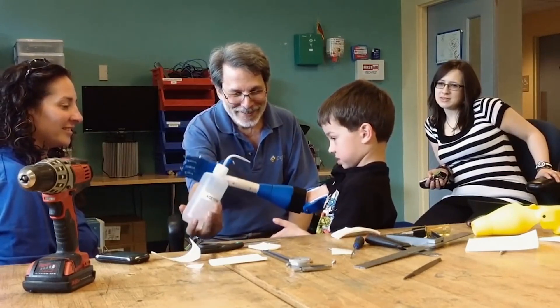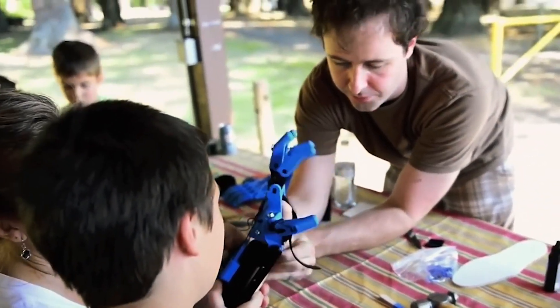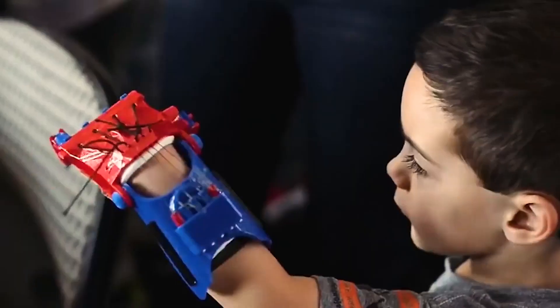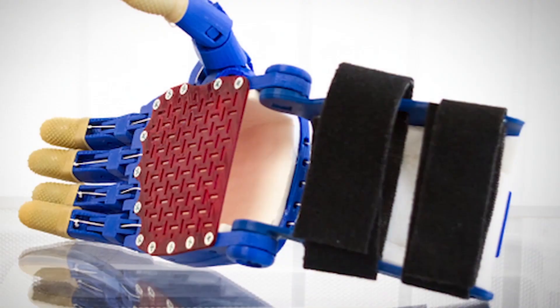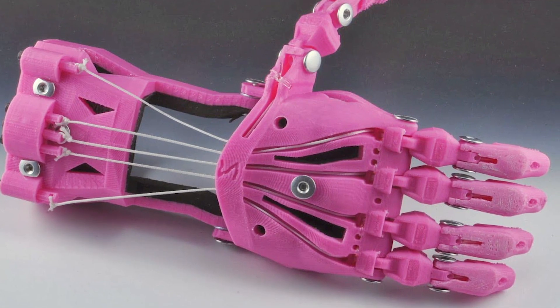ENABLE is a global network of volunteers using 3D printers and 3D technologies to make free, open source upper limb prosthetics — hands and arms — for children and for other amputees who currently are just doing without. We have tremendously creative and innovative volunteers that are constantly coming up with new designs that offer new capabilities.